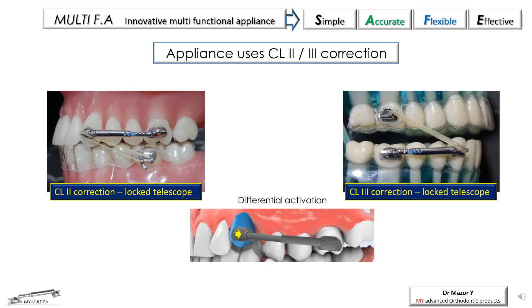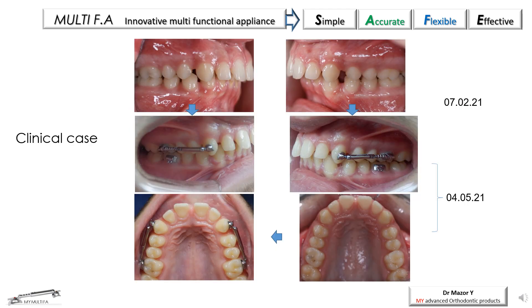A common use of the Multi-Appliance is Class 2 or Class 3 correction. The activation of the telescope can first be differential, as described earlier, with an unlocked telescope until the desired movement is achieved. Then the telescope can be locked for further segmental malocclusion correction. In the following clinical photos, correction of an asymmetrical Class 2 case — full unit on the left side and half unit on the right side — was achieved in three months of treatment using the Multi-Appliance, with no side effects such as posterior cross-bite, undesired rotations, or any other side effect.